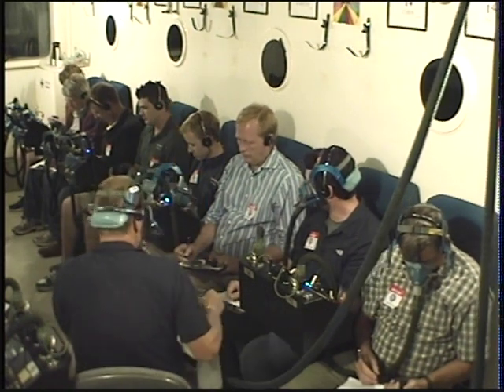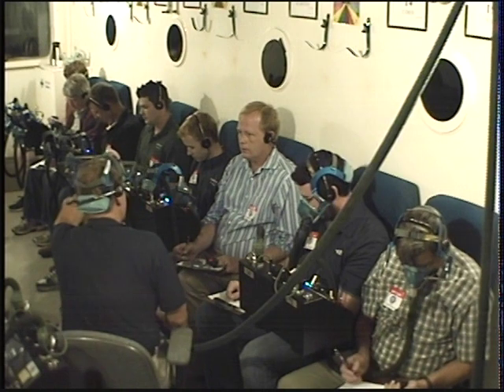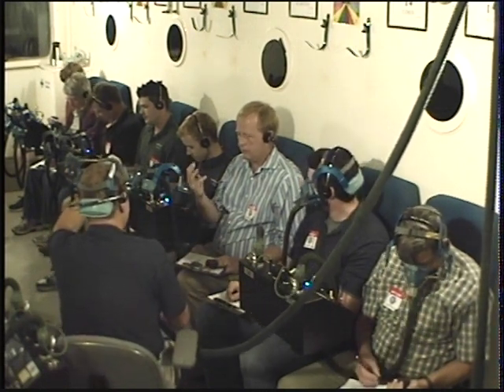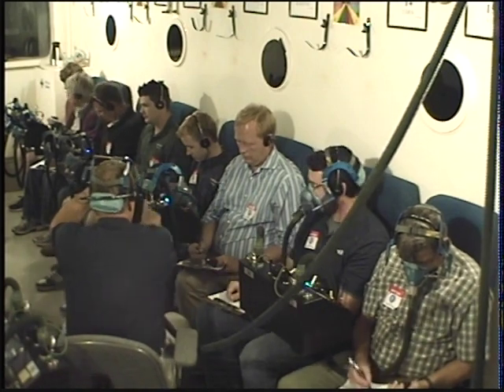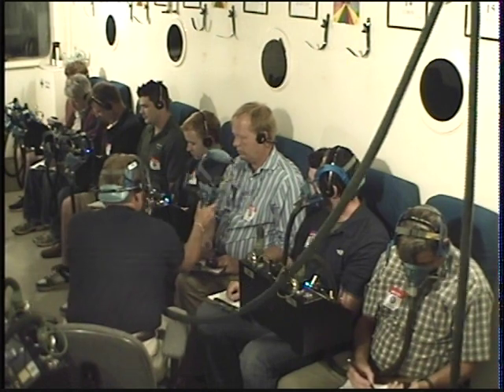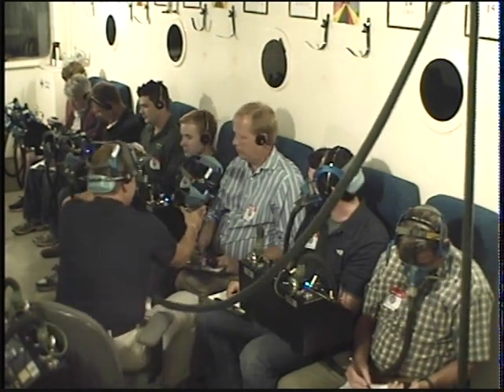And the rest of us, if you are off oxygen at this point, you need to go to item number 4, and put a check mark by any symptoms that you're experiencing at this point. How you doing, Steve? Michael's gone to sleep. Okay. Michael, you doing okay? Karsten, you think you need oxygen?